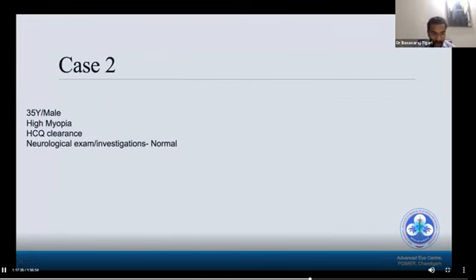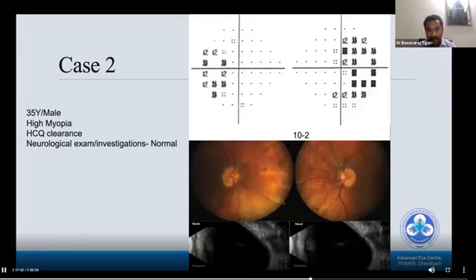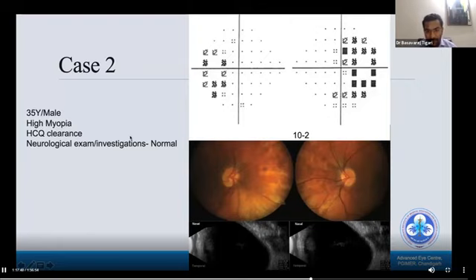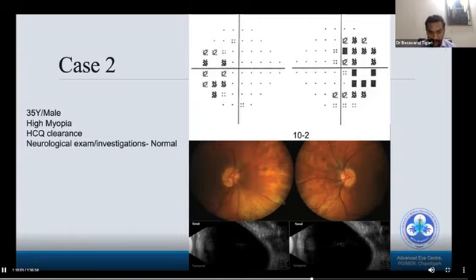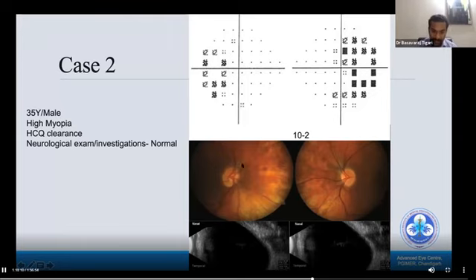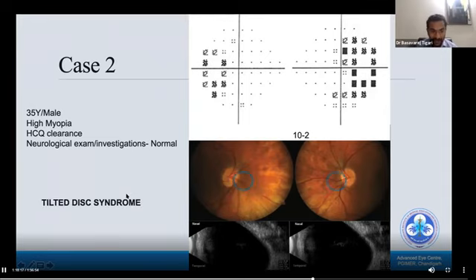Case two: a 35-year-old male with high myopia came for hydroxychloroquine (HCQ) clearance. Neurological examination and all investigations were normal. A 10-2 visual field was done, and when repeated with 30-2, it also showed a bitemporal pattern. Clinical examination was neurologically normal. It took almost one year to diagnose this case. The fundus showed a myopic fundus with a tilted disc evident on ultrasound. MRI was repeated twice. Finally, the diagnosis was found to be ophthalmological, not neurological — tilted disc syndrome can also produce bitemporal hemianopia.